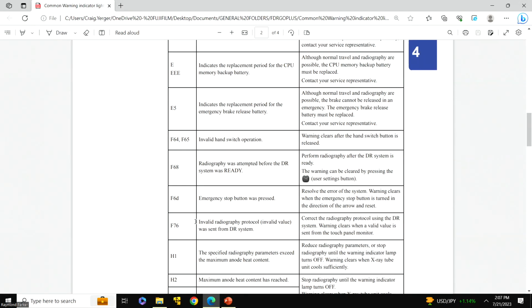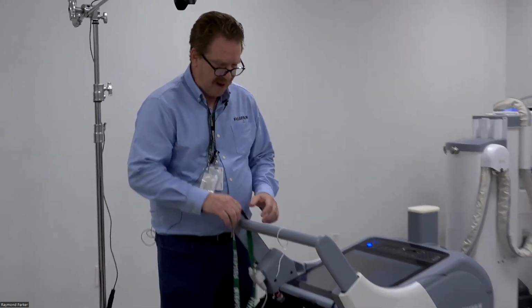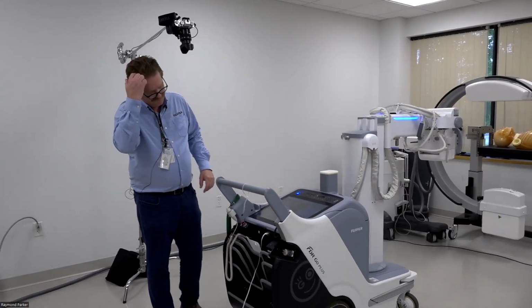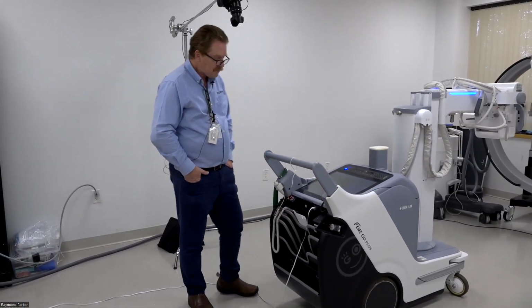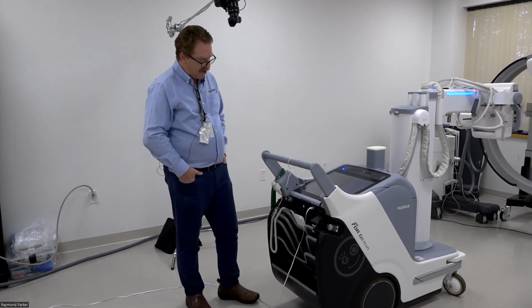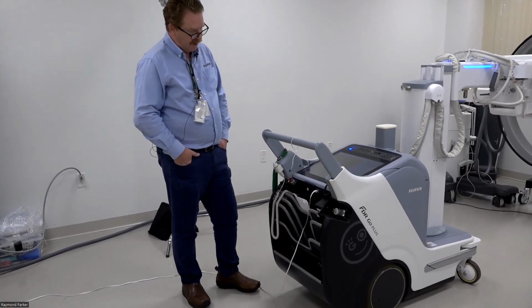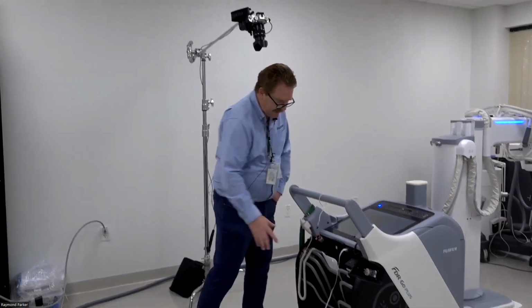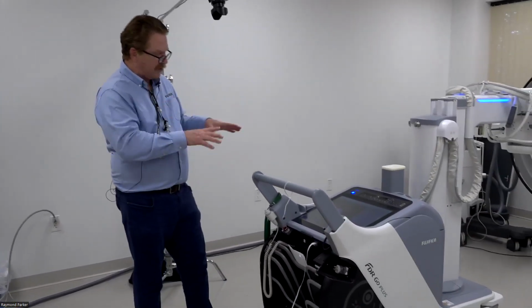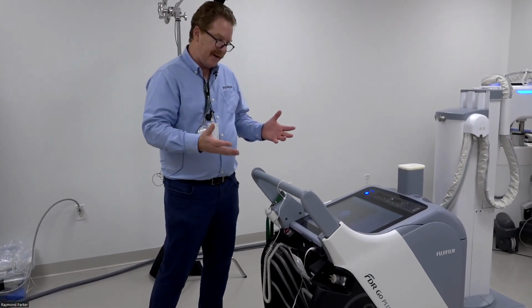And if you can go live, Ray, on the camera. There were two things that I wanted to do as special features. The special features are the emergency brake release. This will only take about a second or two to do each one. So the first one is the emergency brake release. In this situation, the portable drive motor has failed, or maybe your battery's dead.